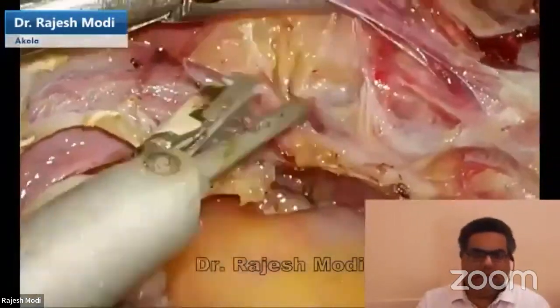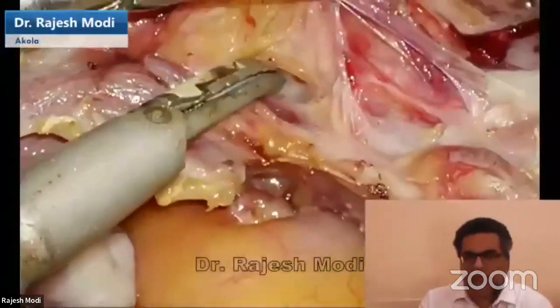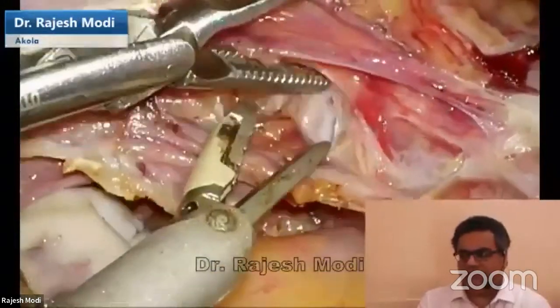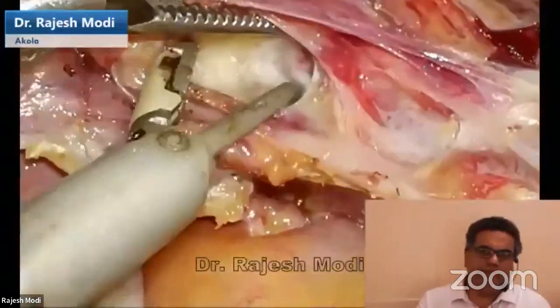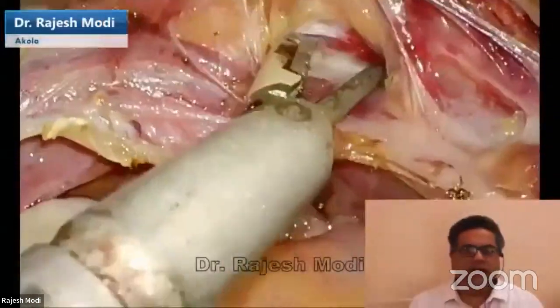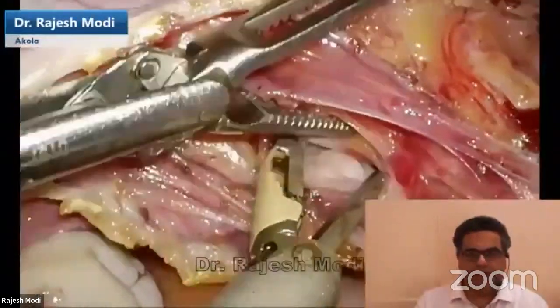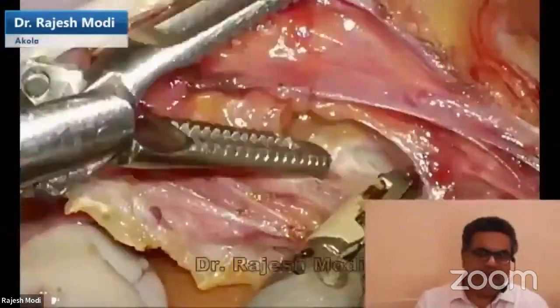Gently tease along the length of the uterine vessel. So parallel to the uterine, I am teasing. And because it is parallel to the uterine, the vein does not get avulsed. The artery will never get avulsed. You can hold the artery, you can lift the artery, you can tug and push the artery. Artery is a strong muscular structure. Never be scared of it.